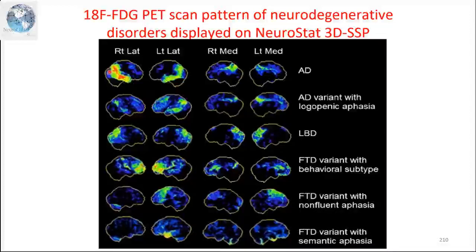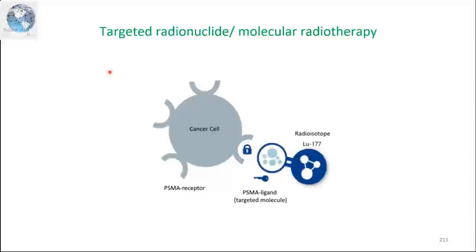So it is highlighting the surface cortical glucose utilization and giving you the ones that are beyond the 2 standard deviations from the normal population. So it gives you a better semi-quantitative way to look at it, rather than you deciding really, is it low or is it high? Okay, so there are softwares to help.